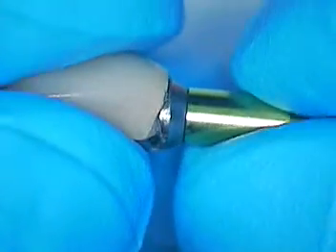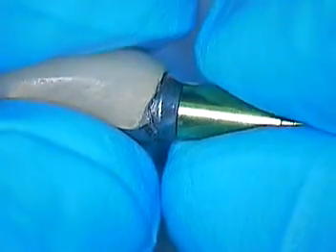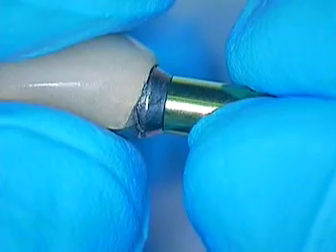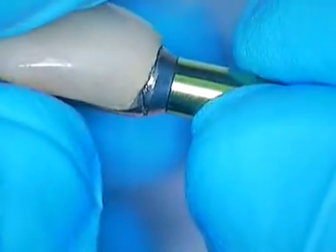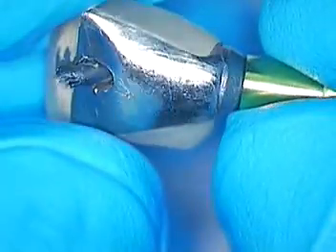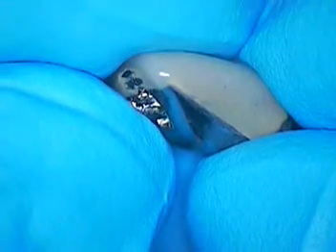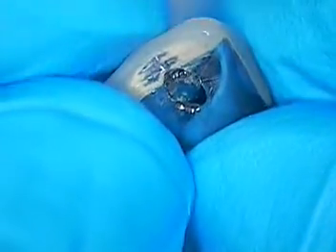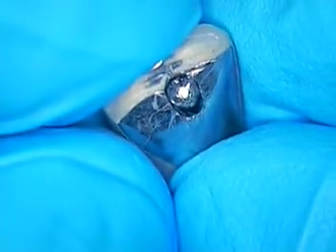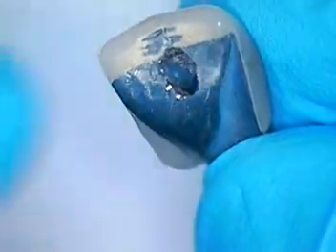We did try hot water — it did not work. I would welcome some other suggestions. We also pre-soaked in a material called TNS, or tartar and stain remover, and it did not quite work either. So you will see I made the lingual access hole, and this is the actual screw — the remnants of the screw — that I am trying to pull through on the lingual aspect of the crown. I am going to continue to do that this evening, but I wanted to show you that we did have to make a small access hole.